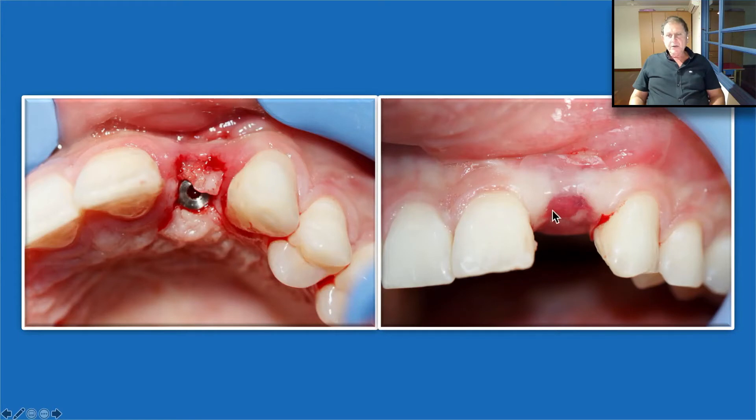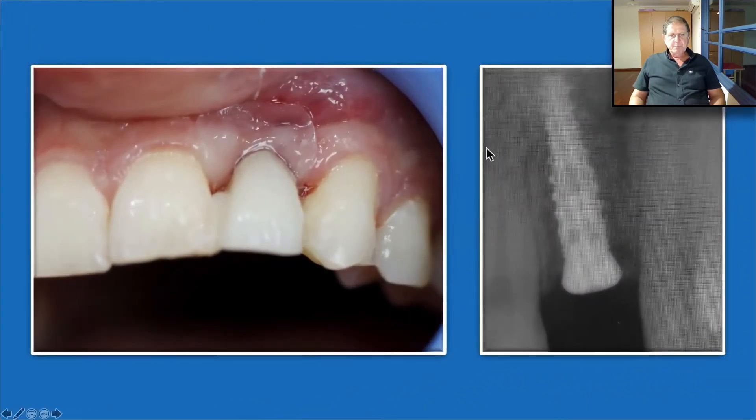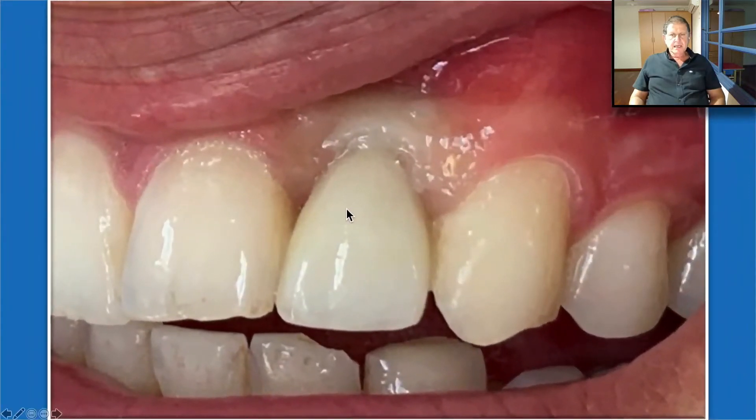We place the Oraid again because we like to protect the site after every surgery we do — it gives us a lot of benefits. That's how it looks with the provisional, the radiographic appearance, and the final result. I think it's a wonderful result with wonderful soft tissue healing.